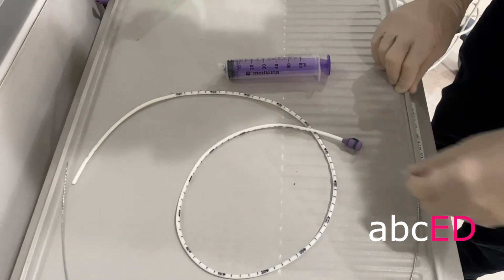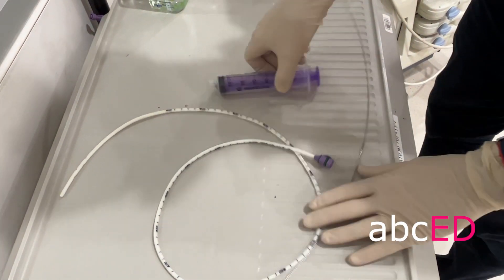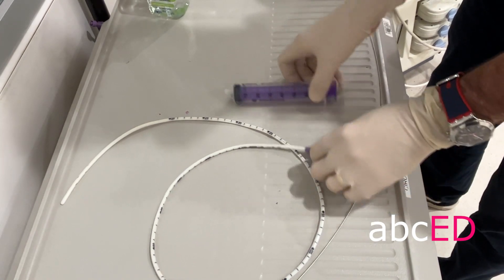We use a nasogastric tube that comes with an introducer, which makes it easier to put in, and a special syringe. Purple — they're a matching pair.